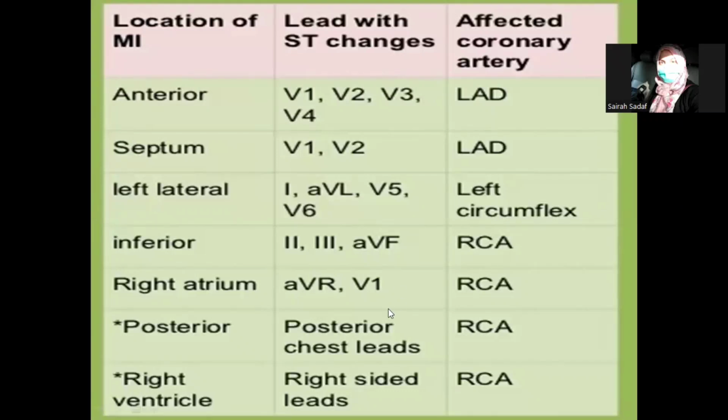And you can take a picture of this slide or you can take a screenshot, because this is a very important slide. Sometimes you get a question in the paper asking, if lead V1 or V2 is involved, which artery is blocked. So you must know that. Okay. Now you have to take the screenshot, and I will move to our next slide.